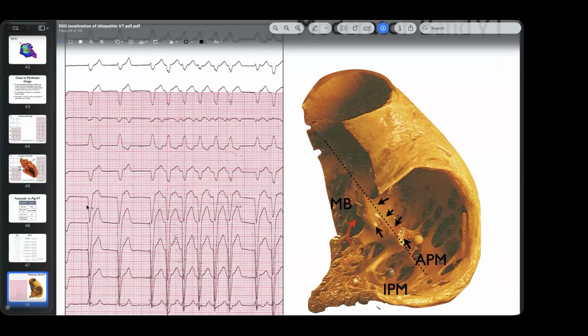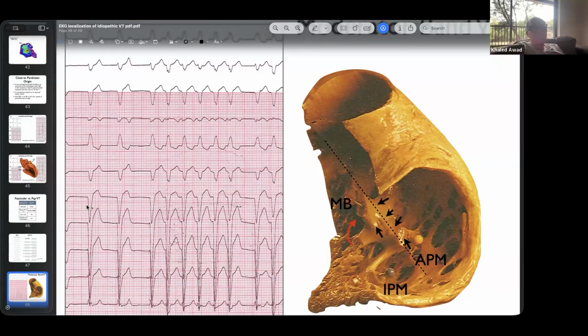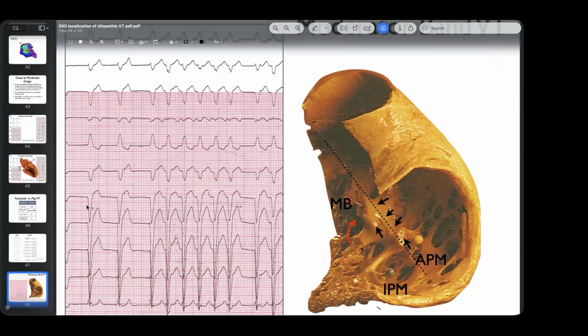Whereas the idiopathic ones, they're usually by the valve. If you're in the right spot, 40 watts is plenty, and they usually go away. Okay. So if you're mapping an idiopathic RVOT PVC, and you have a large area of earliest activation, what does that mean?